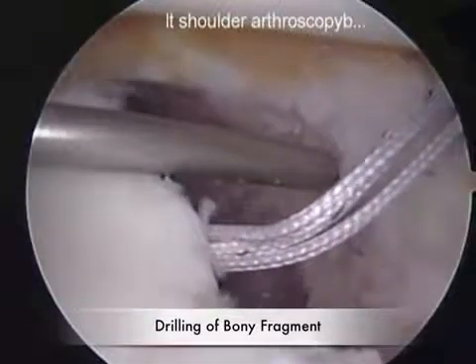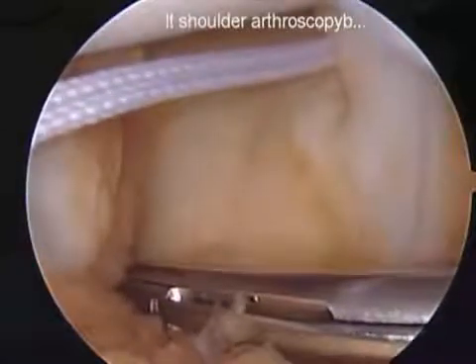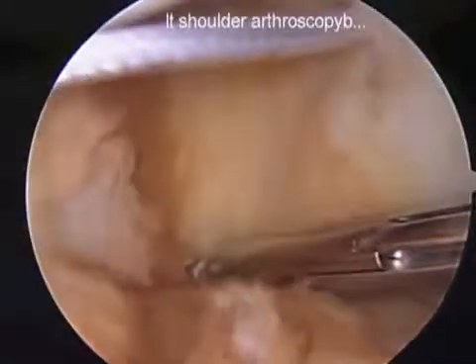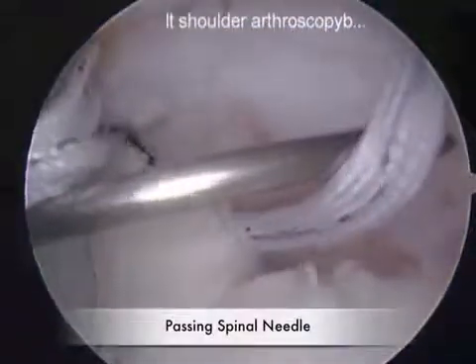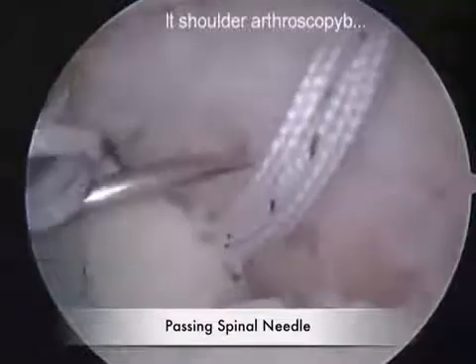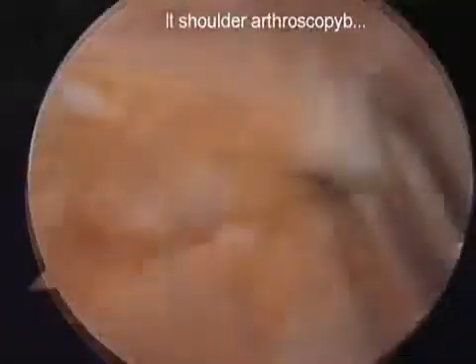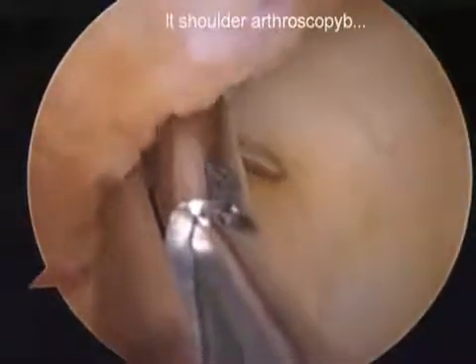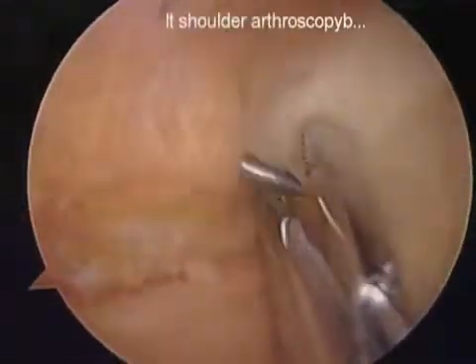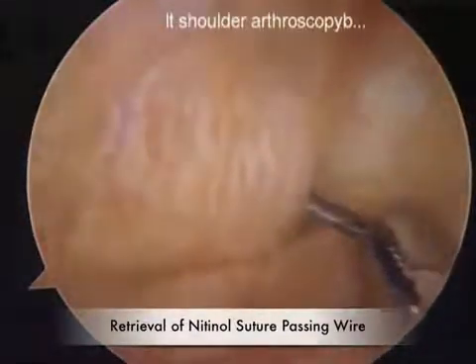A 1.6mm guide wire is drilled through the bony fragment and visualized on the anterior side of the capsule. This is followed by a standard 5-inch spinal needle, which is passed through the drill hole and again isolated on the anterior aspect of the capsule. Once this is accomplished, a nitinol suture passing wire is passed through the spinal needle and retrieved out the anterior-inferior portal.